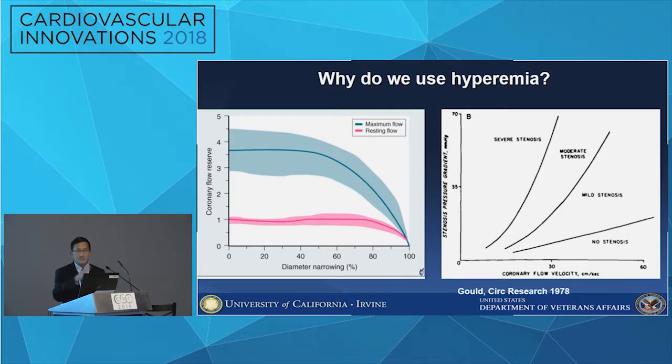This is how we got to the angiographic correlate of about a greater than 50% stenosis, at least having the potential to demonstrate ischemia. And that's why historically we don't stent anything less than 50%. We shouldn't be stenting anything less than 70%. And that's how we get to our angiographic nomenclature of always naming something that we stent 80% or more, and anything we don't stent as 50% or less, even though really angiographically we can't tell.